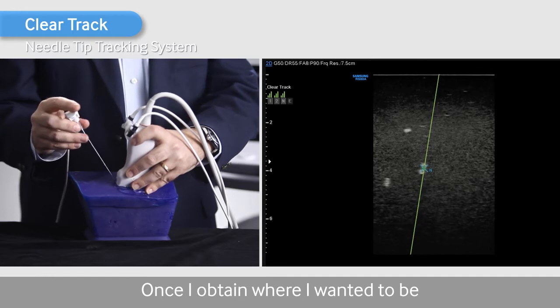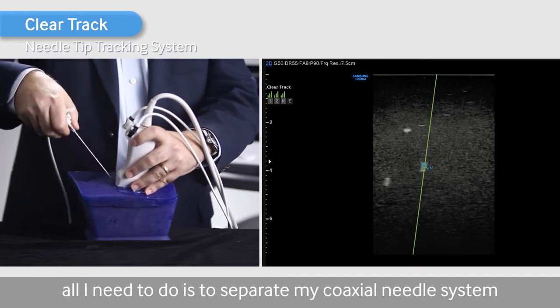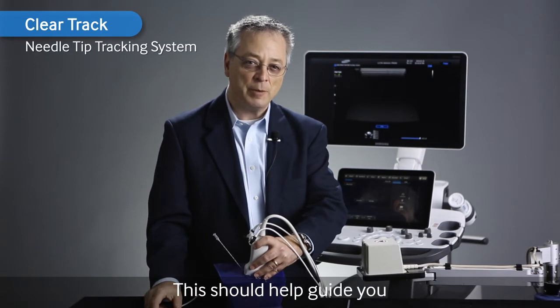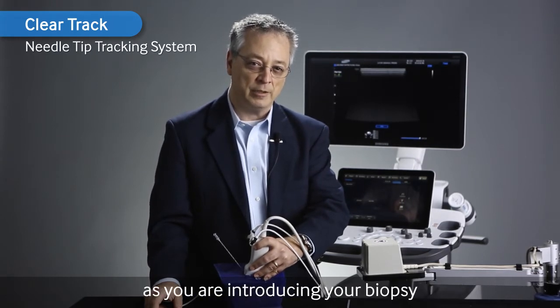Once I've attained where I want it to be, all I need to do is separate my coaxial needle system and remove the inner stylet and maintain the cannula for my procedure. This should help guide you with more confidence to where you need to be as you're introducing your biopsy.